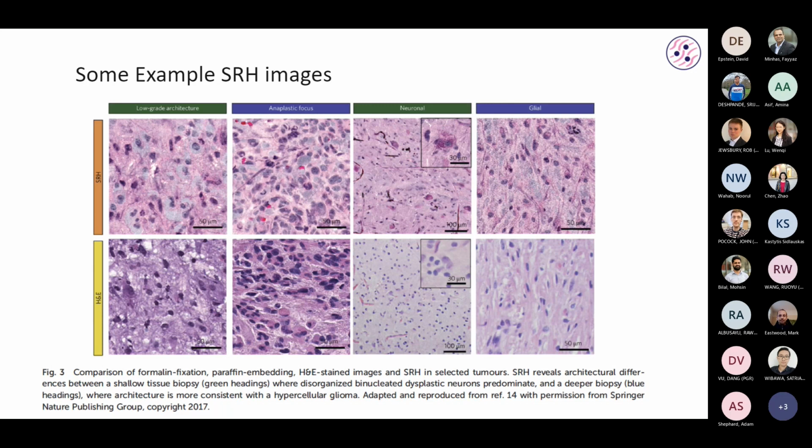On the second question by John, so I think he's talking about the image that we showed earlier. Yeah, so I've got another question. It might not be super specific to it, in that it could be highlighting DNA in the nucleus and mitochondrial DNA, hence the dark patches outside the main nucleus blob. Listeners ahead were speculating what the other dark blobs were, so that was my guess. Yeah, that could indeed be right. But again, that's potentially useful information in there as well. So it's not necessarily a bad thing.